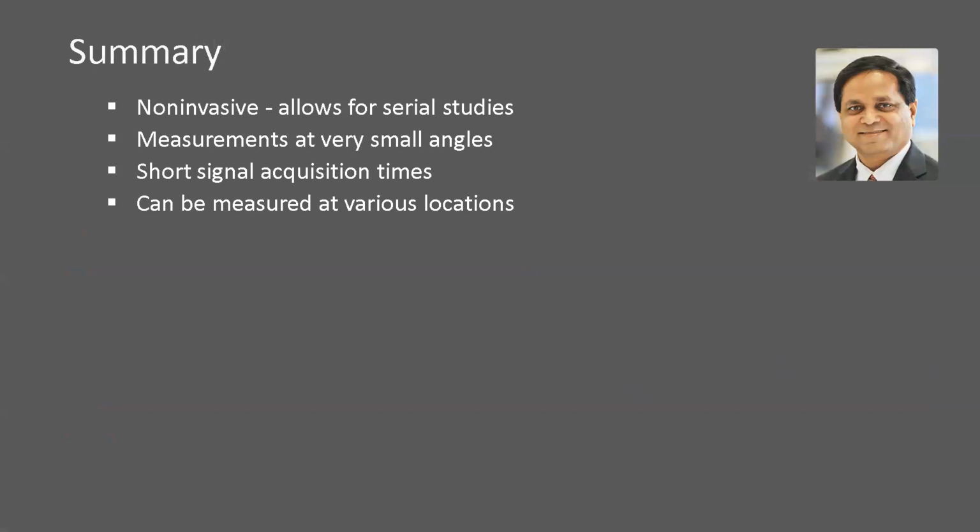And in summary, the Doppler system is non-invasive, so it allows for serial studies. As I mentioned, very small angles make the measurements more accurate, and you don't have to do the angle correction, because a lot of times you cannot figure out what the angle is. And if you keep it low, then the errors are low. Short signal acquisition times: within a few minutes, you can get your signals. It takes more time to set up the mouse than to get the signal.